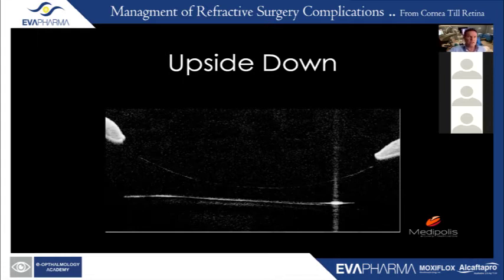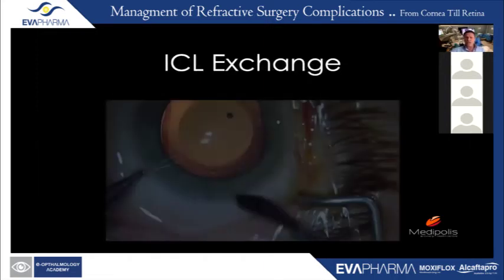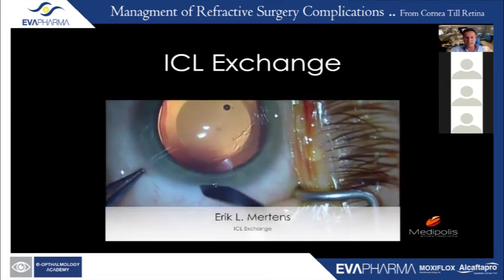He noticed it the day afterwards with a very peculiar refraction with hyperopia and astigmatism. Only by doing the OCT did he find out that the ICL was upside down. Of course, then you have to exchange the ICL, and I will share with you my technique here.